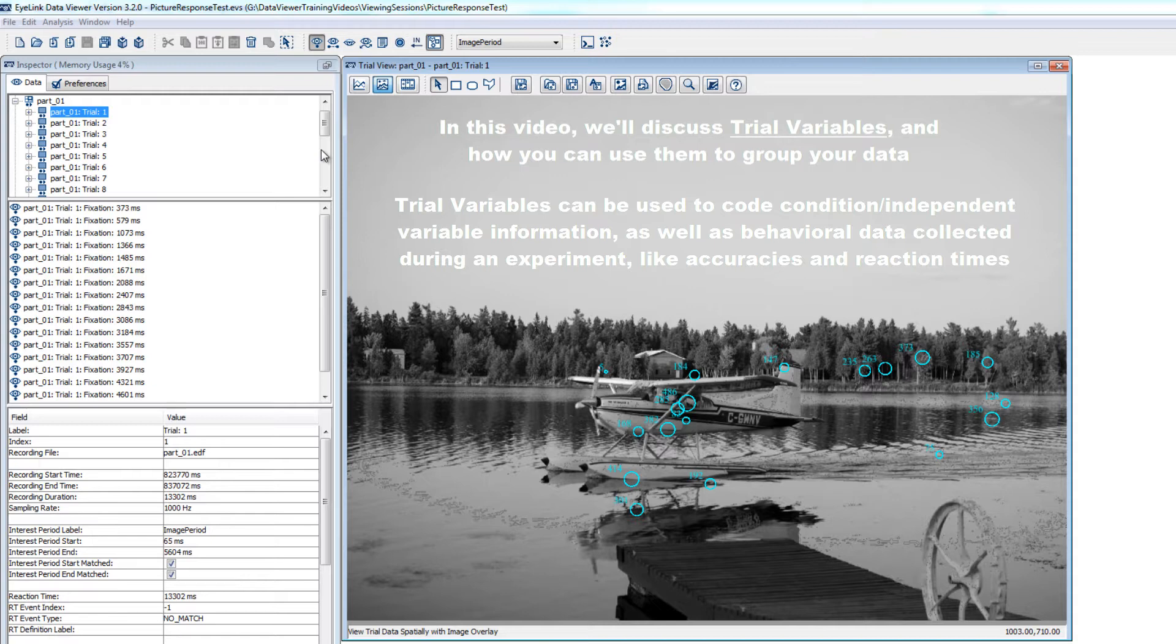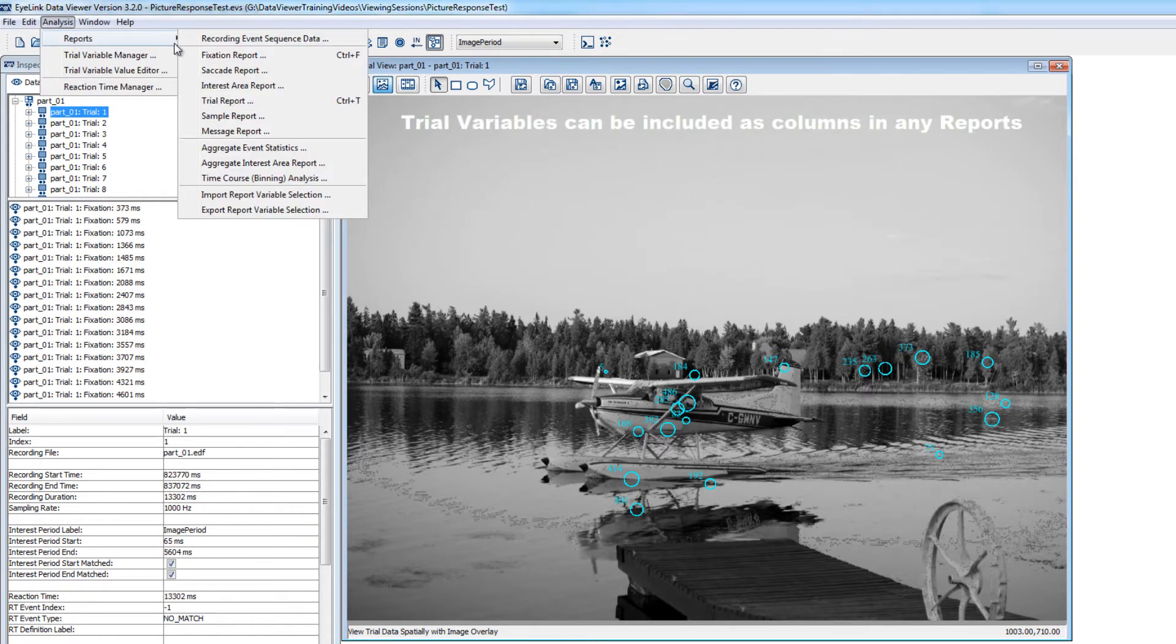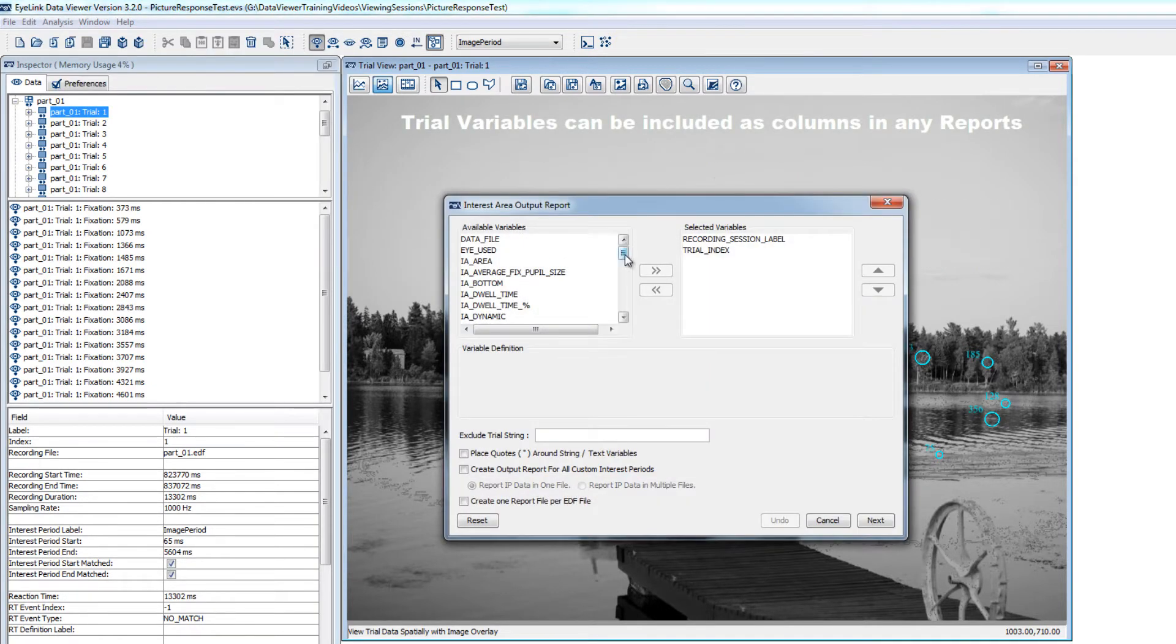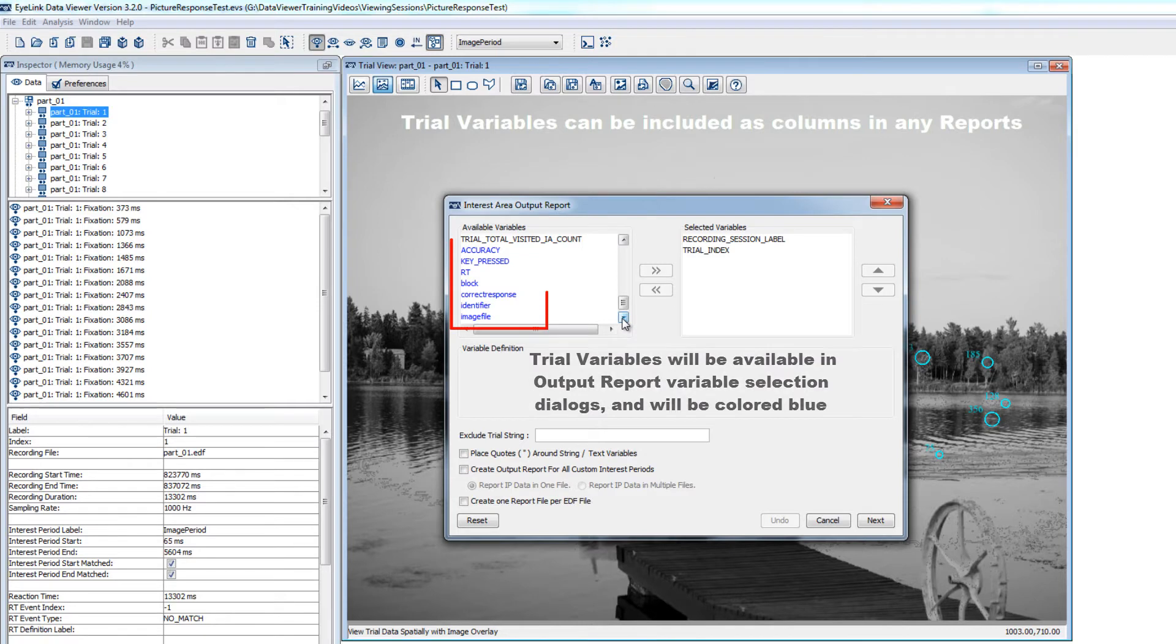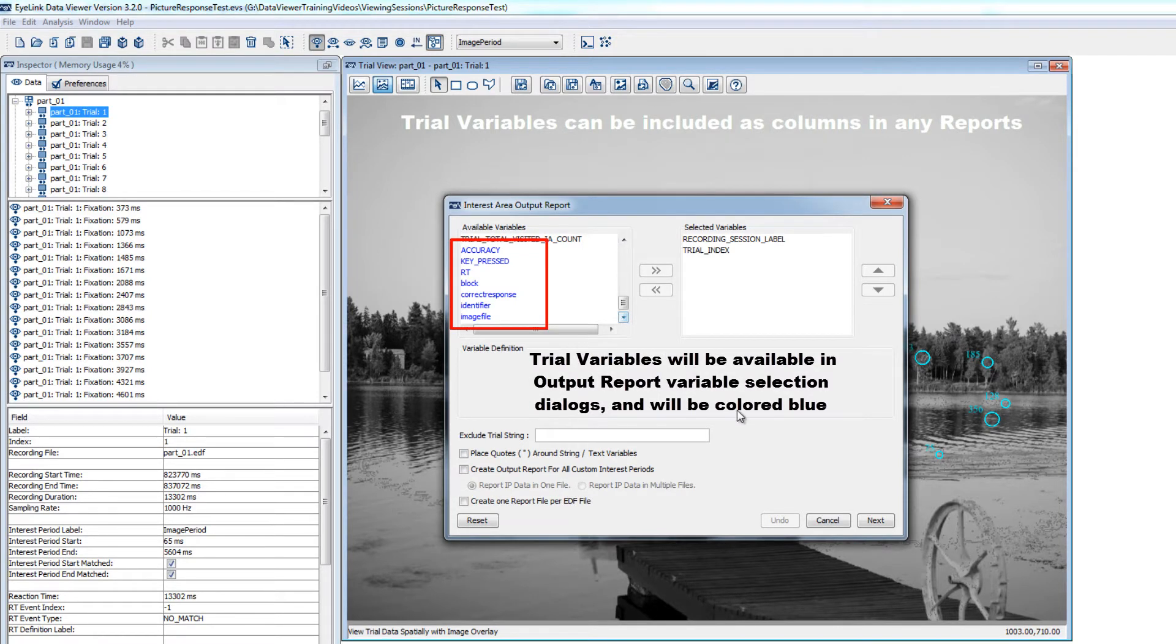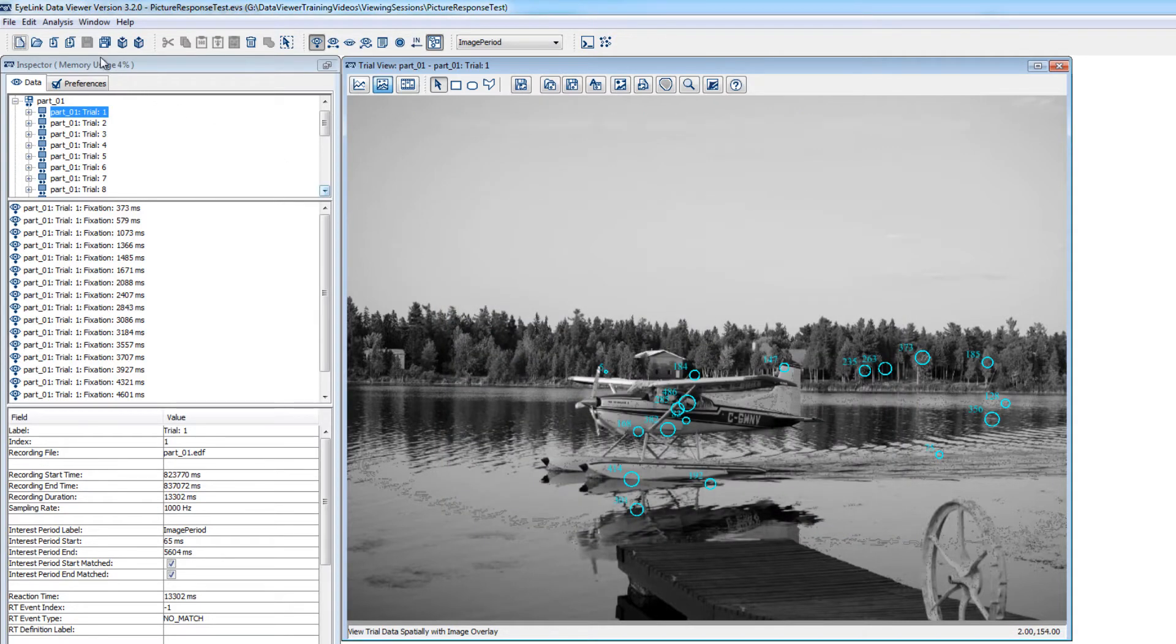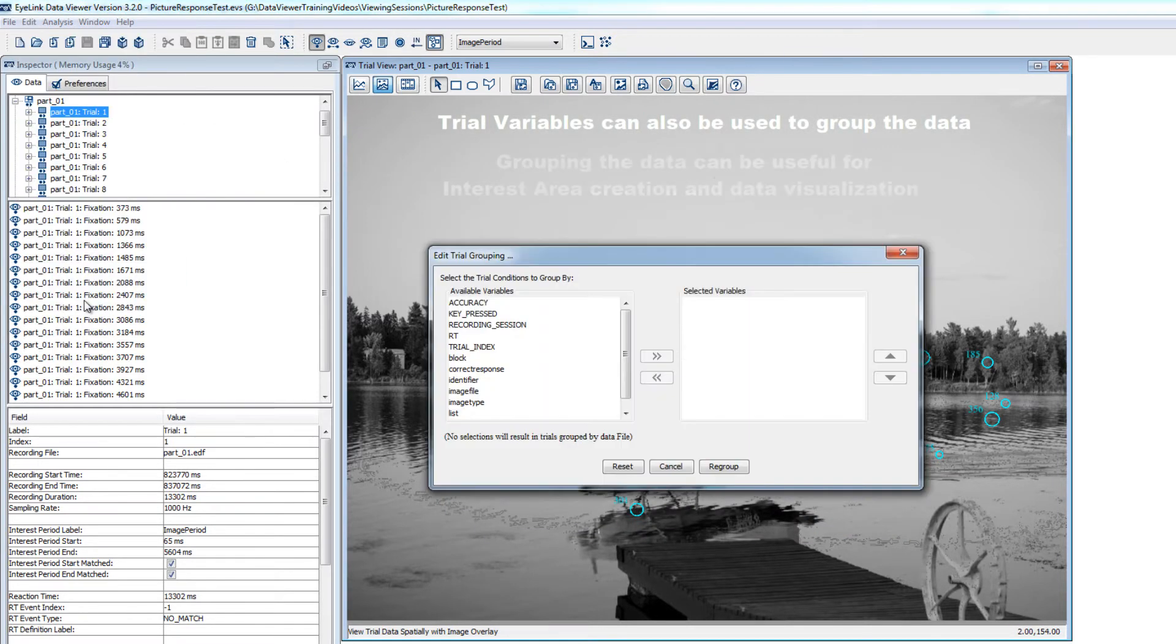This information can be handled in Data Viewer via the use of trial variables. Trial variables are central to Data Viewer as they can be added to any output data reports that you create from Data Viewer, allowing you to have all your experimental manipulation information and any behavioral data that you might need right there in your reports along with the eye-based data. They are also really useful as they can be used to group your data, which can help for certain parts of the analysis process, including interest area creation and data visualization.